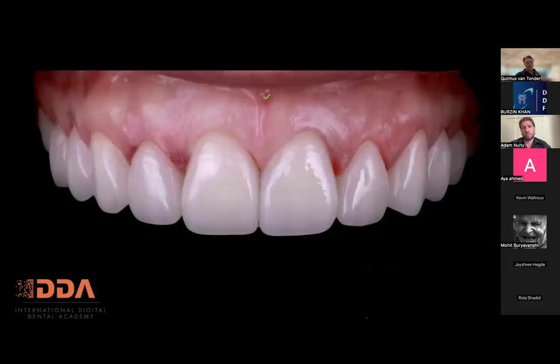So we did basically from the 5 to the 5. I call this sort of the 3-4-3 principle. So we do veneers from the canines backwards, and we do crowns on the front teeth. In this case, we had to do it because she had some interproximal decay, but very thin, like 300-400 micron crowns, and 300-400 micron veneers, to get the result for this patient.